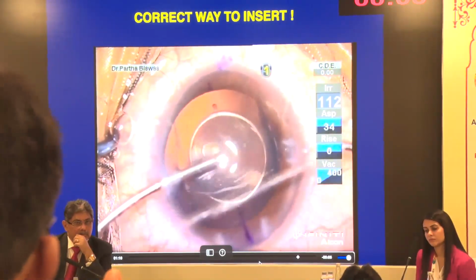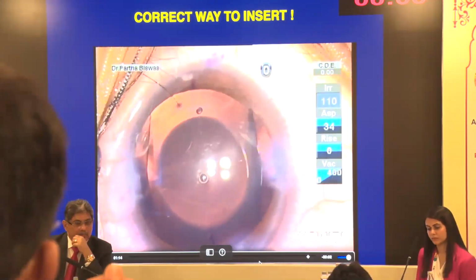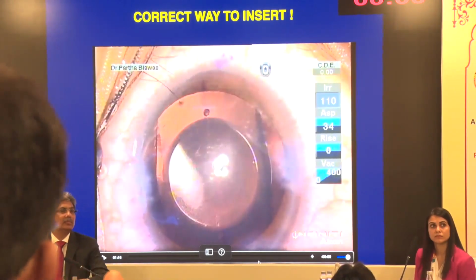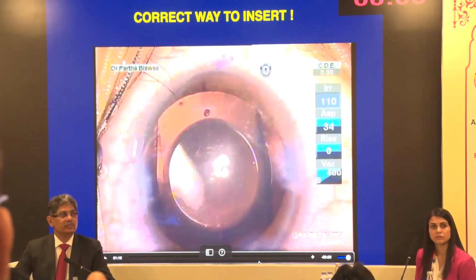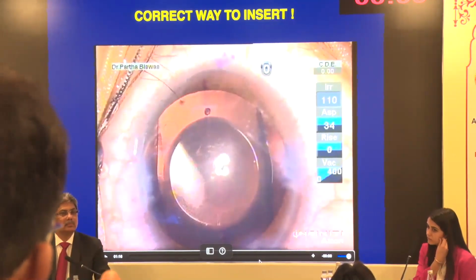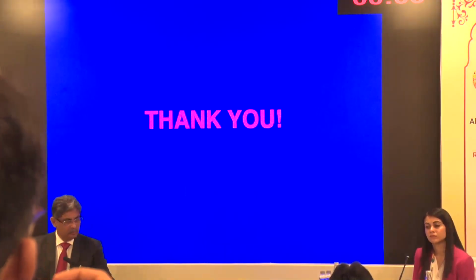Please do it meticulously. Please remember. And hydration through the tip, through that central hole, is best not to be done. If you want to do it, you can, but just for a few seconds so that you just wash away a little. Because if a jet goes in and impinges on the anterior capsule, then there's literature that it has produced cataract. So be very gentle, but as much as possible, remove the viscoelastic. Thank you very much.